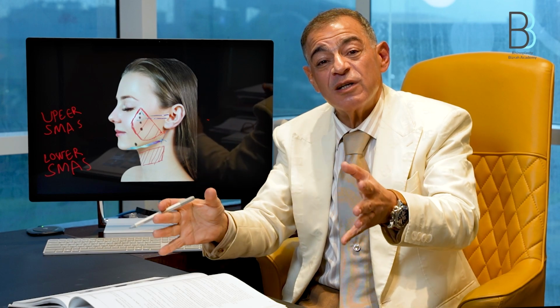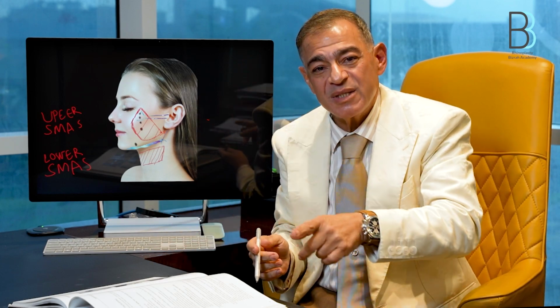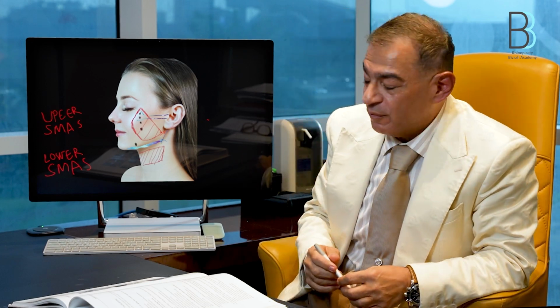The same principle as an ECG machine. You have electrodes connected there, and these electrodes are connected to a monitor. If you get close to the facial nerve, you will get a warning and a beep straight away. You will see it in our coming video on teaching on the facial nerve.